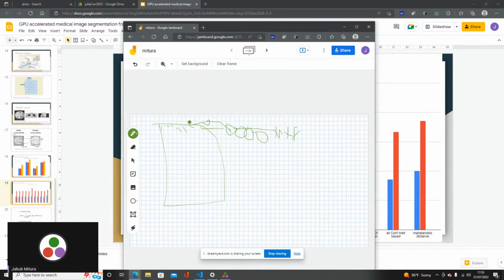Yes, so we get each voxel, neighborhood around each voxel, we get the standard deviation and mean. We put this data into each of the Gaussian distributions, yes, and we get the maximum from all of those executions. What is critically important, this is millions upon millions of operations.